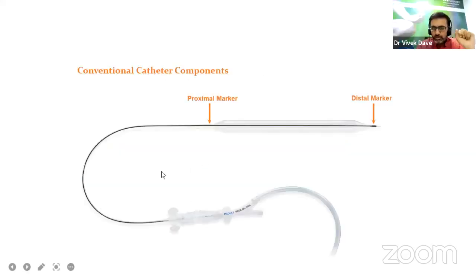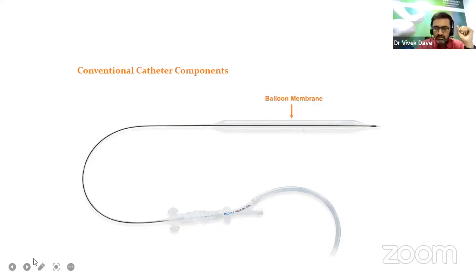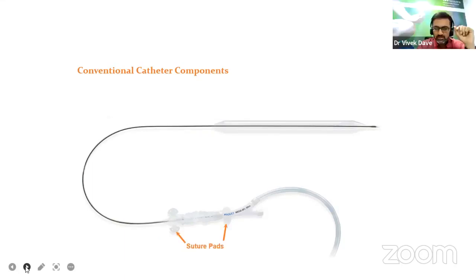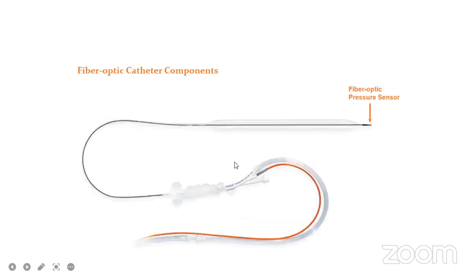These are the components of the conventional catheter. You can see the proximal and distal marker. This entire assembly is the intra-aortic balloon pump. This is the balloon membrane — what we need to inflate and place. This is the gas lumen and inner lumen through which helium gas will travel. This is a universal sheath seal, suture pads, a stat-guard sleeve so the assembly is well guarded, and a Y-fitting with extracorporeal tubing to be connected with the IABP machine. This is the fiber optic pressure sensor.